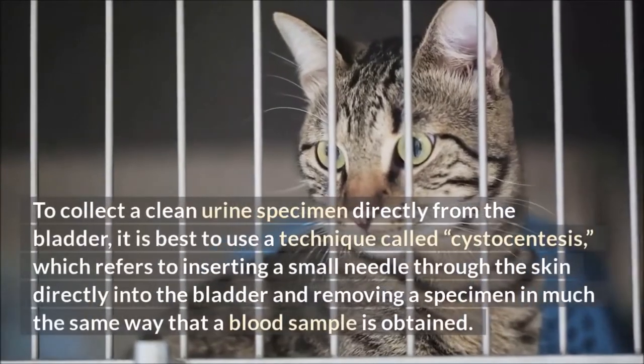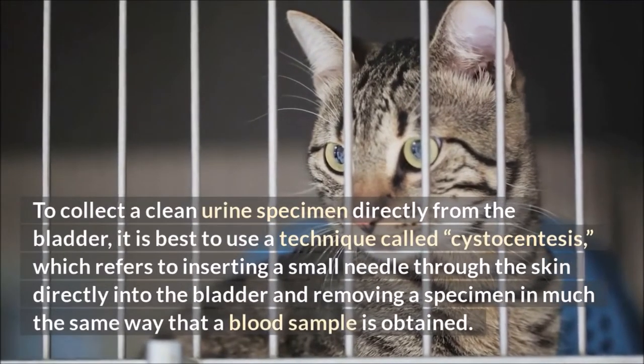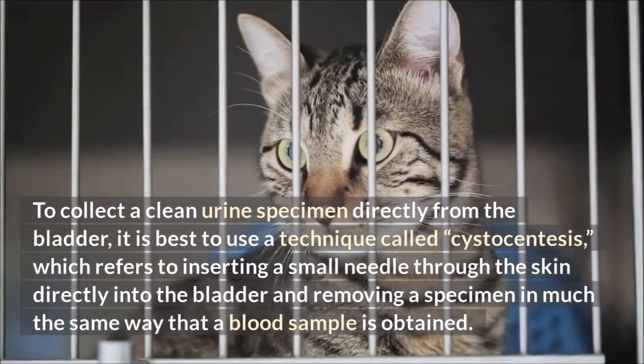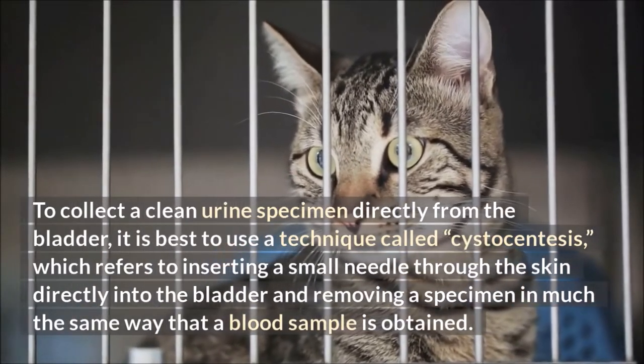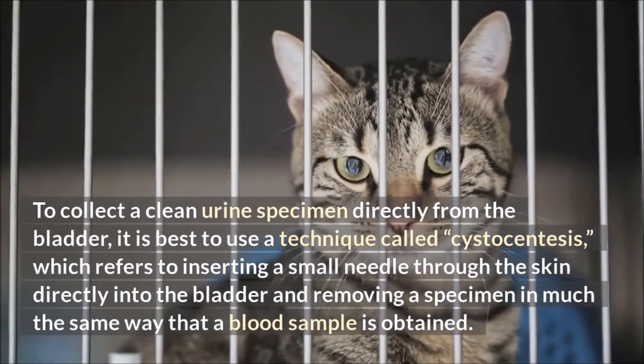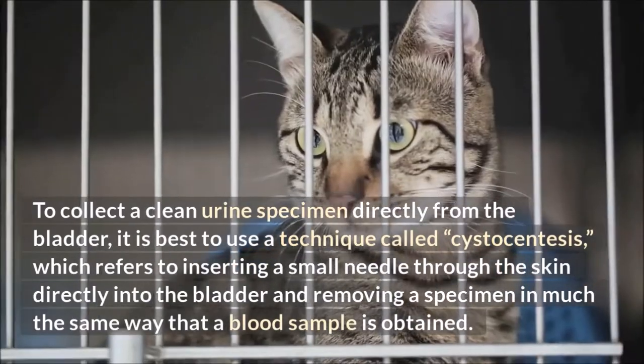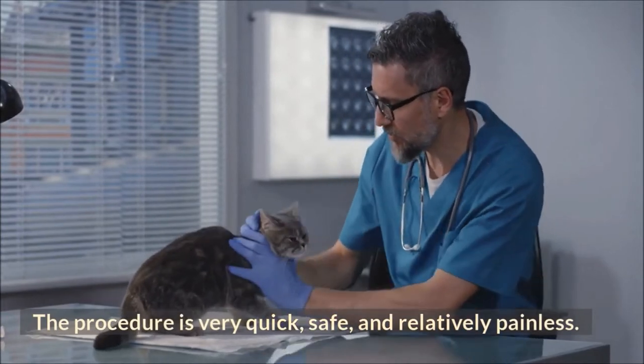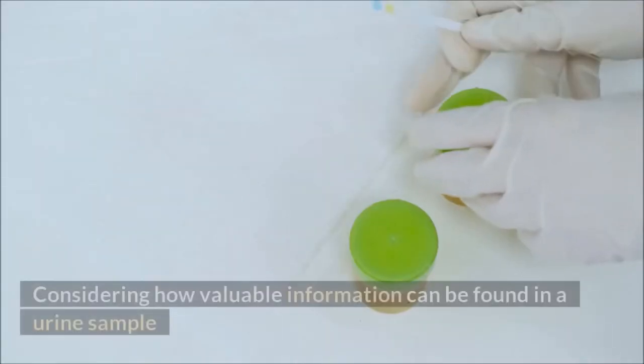To collect a clean urine specimen directly from the bladder, it is best to use a technique called cystocentesis, which refers to inserting a small needle through the skin directly into the bladder and removing a specimen in much the same way that a blood sample is obtained. The procedure is very quick, safe, and relatively painless.